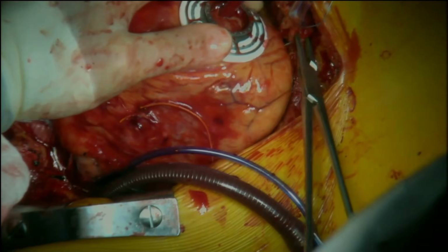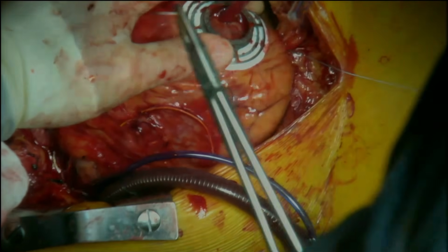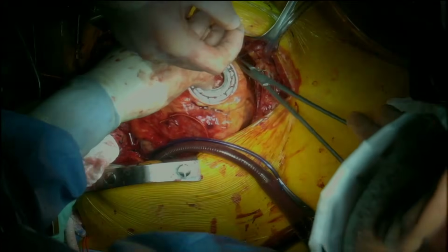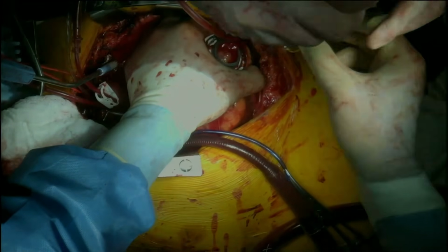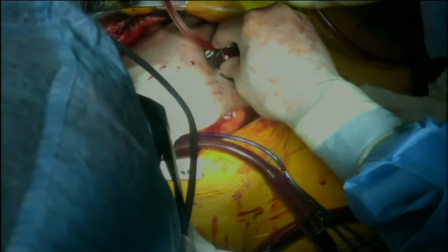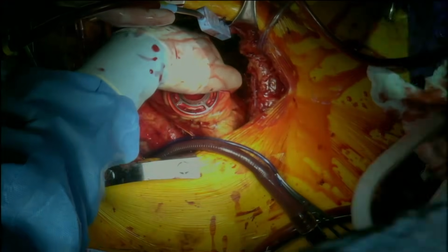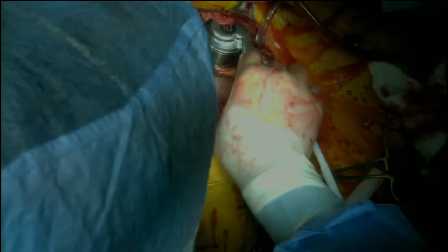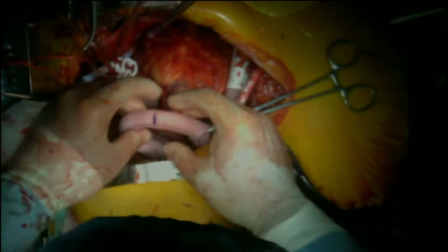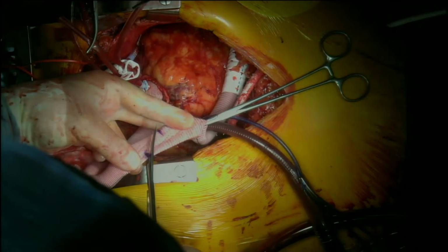Attention is then turned to the LVAD implantation, and the apical sewing cuff is positioned. The cuff is secured to the left ventricle apex. The ventricle is cored and the HeartMate 3 inflow cannula is implanted. The outflow graft is measured and tailored to the appropriate length.